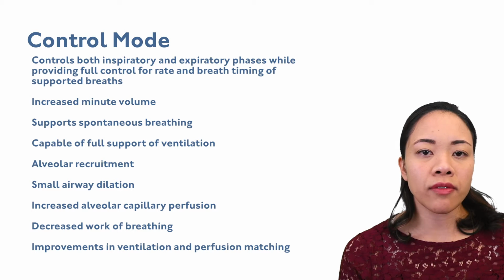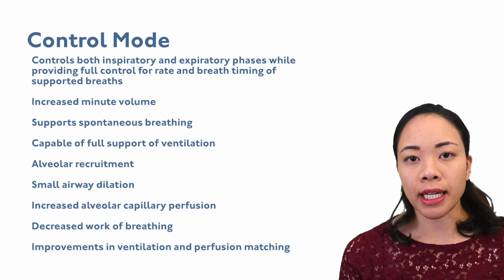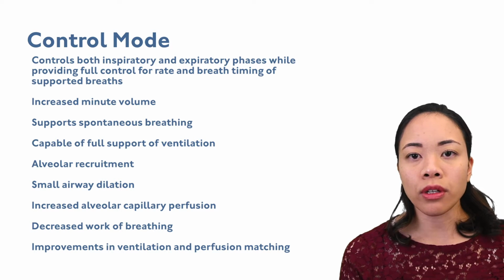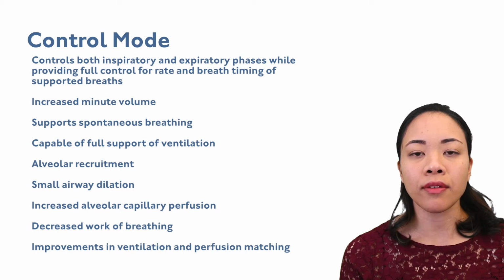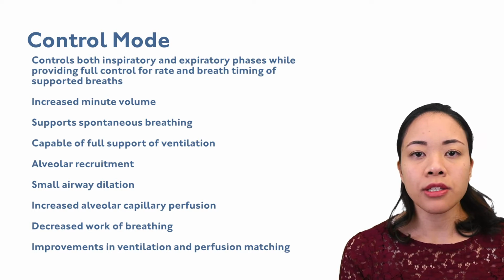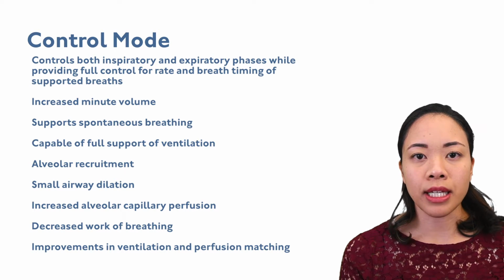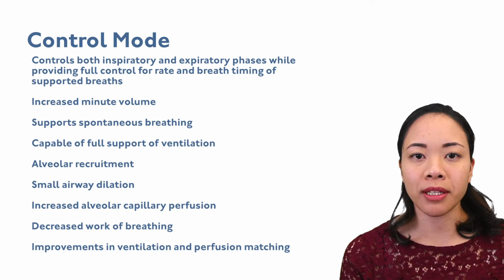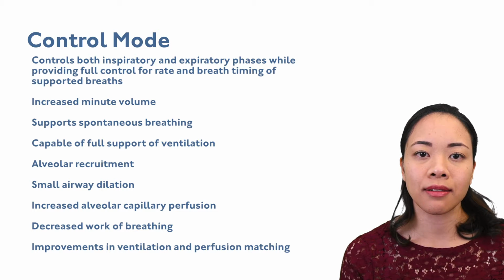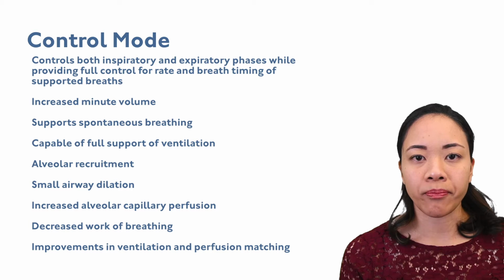The physiological effects of this mode on the body include that it controls both inspiratory and expiratory phases while providing full control for rate and breath timing of supported breaths. Increased minute volume, supports spontaneous breathing, capable of full support of ventilation, alveolar recruitment, small airway dilation, increased alveolar capillary perfusion, decreased work of breathing, and improvements in ventilation and perfusion matching.